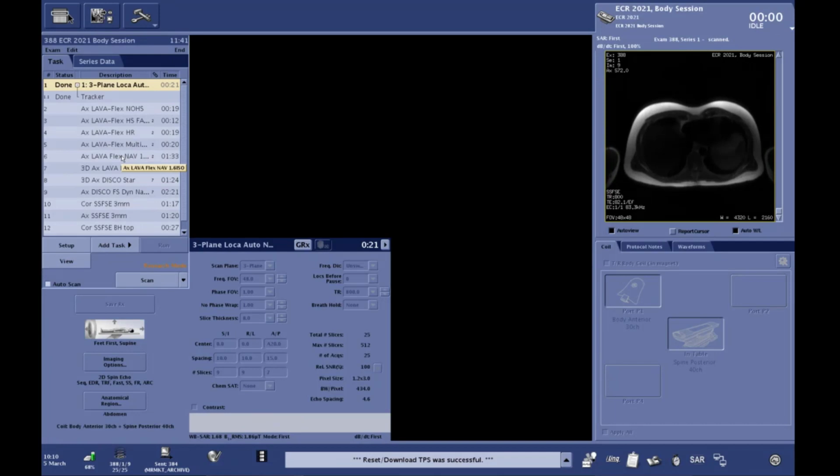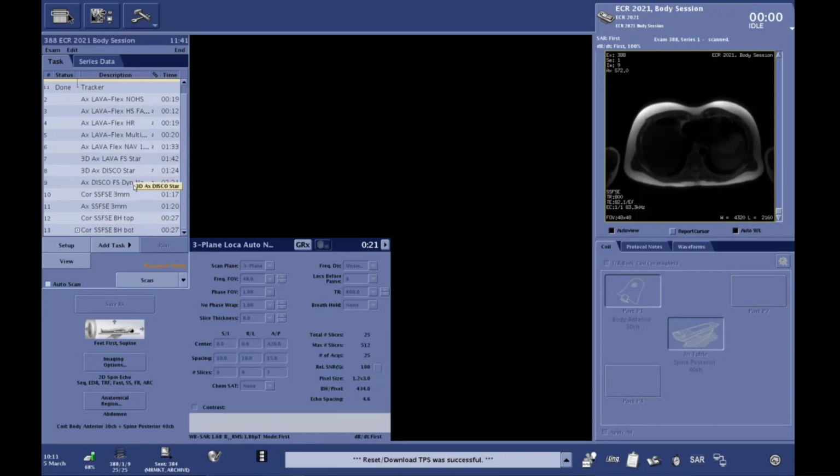Then, to continue to speak about this breathing pattern management, we will see some free breathing techniques. You will see that we have a large portfolio to give you this opportunity to adapt your way of working to your patient. And then another important challenge we are facing doing MR for body is the quantity of signal. At the moment you need high resolution or thin slices, you will have really an important penalty in terms of SNR. And we will demonstrate this deep learning reconstruction algorithm we have on our system that could really be useful in those kinds of examinations.